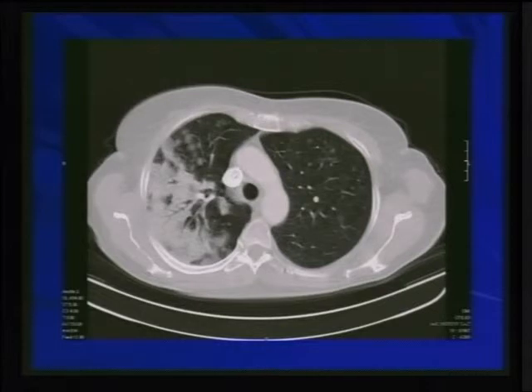This is a good example of bacterial pneumonia, showing that in early and minimal disease, you have this very fluffy, small, round opacity with poor margins. So those are at the level of the acinus. This is the size of an acinus, 5 to 8 millimeters.